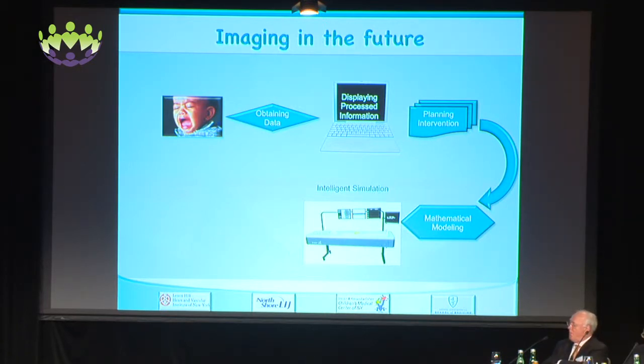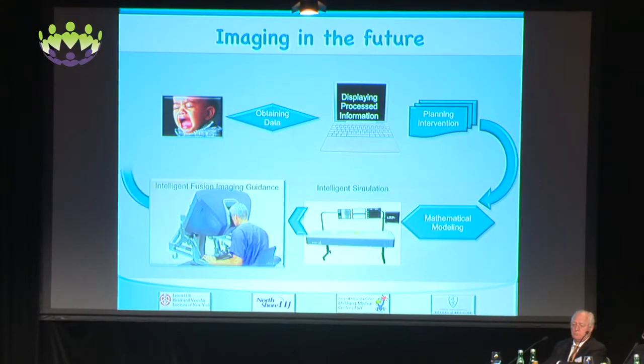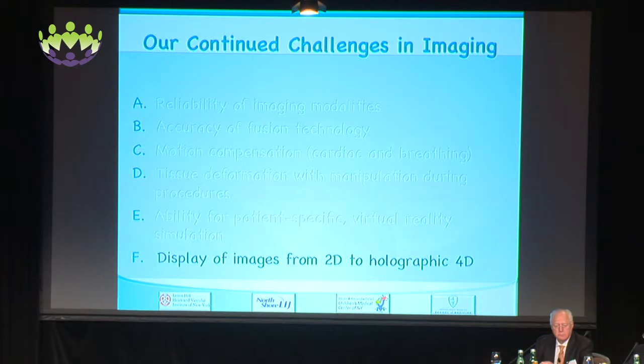Then, based on the results of this simulation, if you succeeded 80% of the time, or 100%, in closing that appendage successfully, that is information that can be extracted and brought into a computer that can guide the implementation of those procedures in different ways.